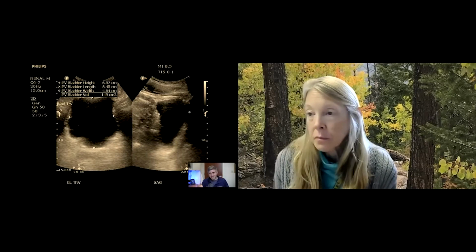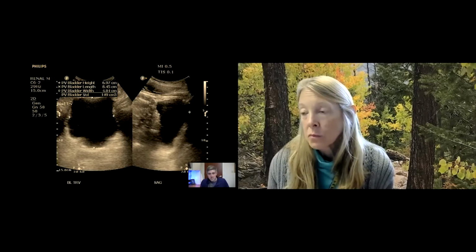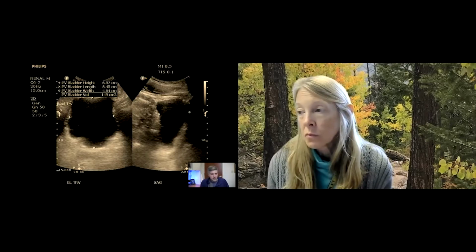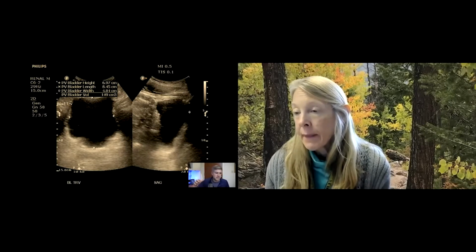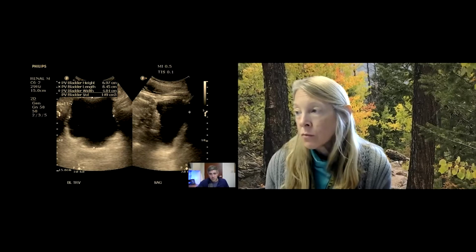And one interesting thing, just as an aside, is that because the bladder is full of fluid, which doesn't reflect the sound waves, the sound travels easily through that bladder. You're going to have something called posterior acoustic enhancement deep to the bladder. If you look in the far field deep to the bladder, you'll notice that the echogenic material is a lot brighter just underneath the bladder than it is off to the sides. That's because when you pass sound through a fluid-filled structure, there's no attenuation of that sound, compared with the surrounding things that you're scanning, where there is attenuation.